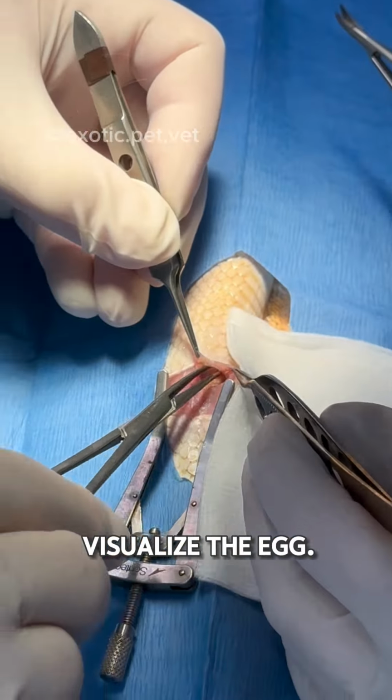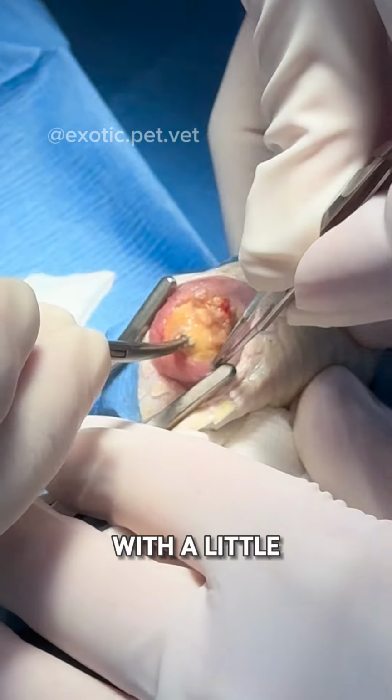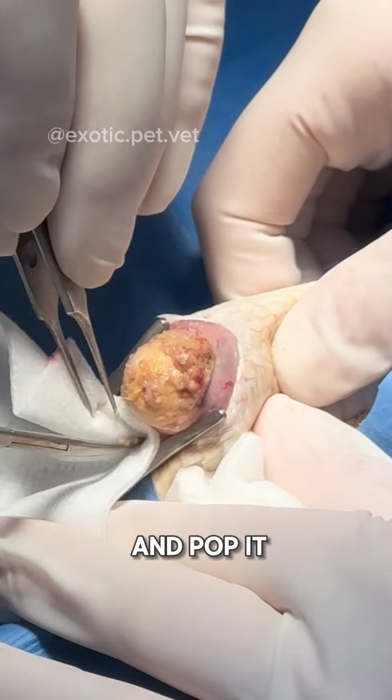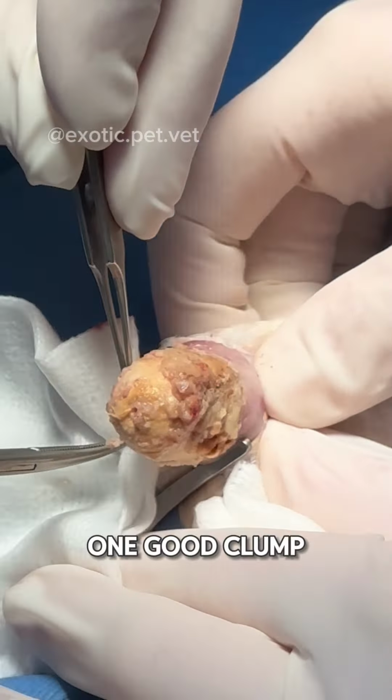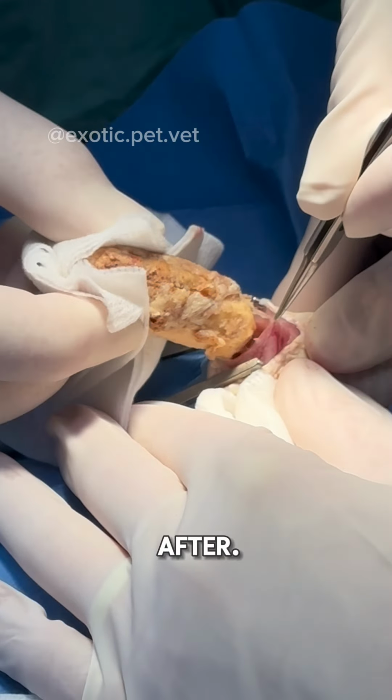Finally, we could visualize the egg. We wanted to get the egg out of as tiny of an incision as possible. With a little manipulation, we were able to angle it and pop it right out. One good clump of egg came out, but because it had become rotten, there were some chunks left behind that we had to go after.